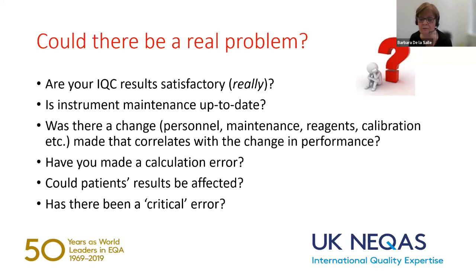Doing proficiency testing or EQA is not just a tick box exercise. We are trying to work in partnership with participants in order to improve and maintain the quality of the patient's results. So do go back and ask whether your IQC results are satisfactory, and really satisfactory, not just borderline. Is all your instrument maintenance up to date? Has there been a change in personnel, maintenance, reagents, calibration, etc., lot changes which might correlate with a change in performance?